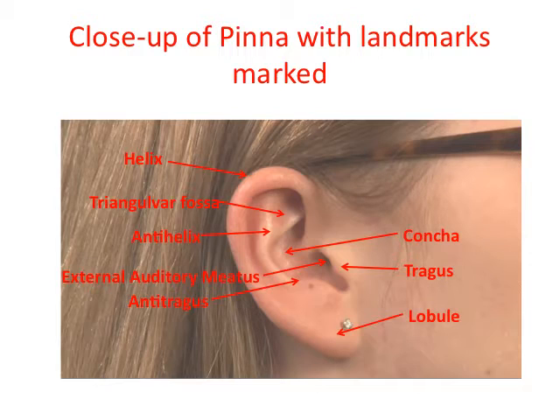Following the examination of the pinna, we're going to examine the external auditory canal and the tympanic membrane. Now I'm going to put the speculum on the otoscope — it just twists on, just like that — and then turn it on again.